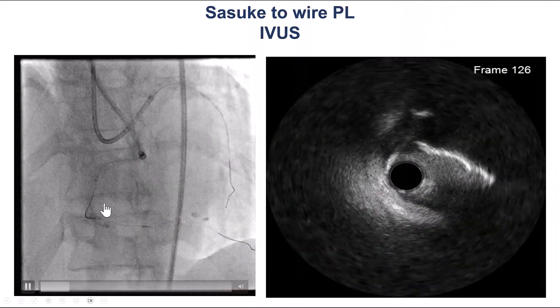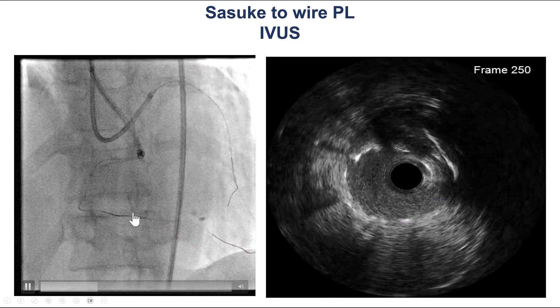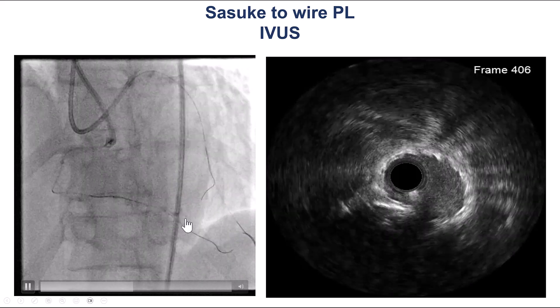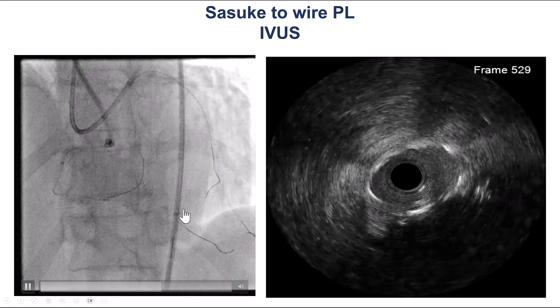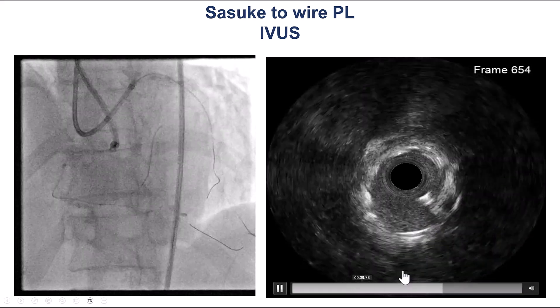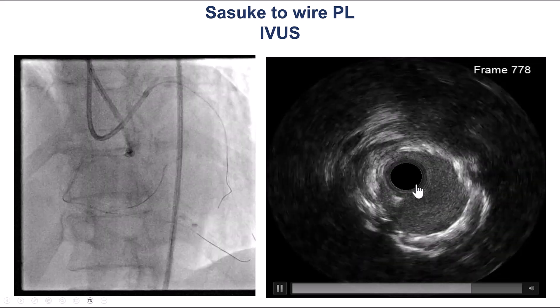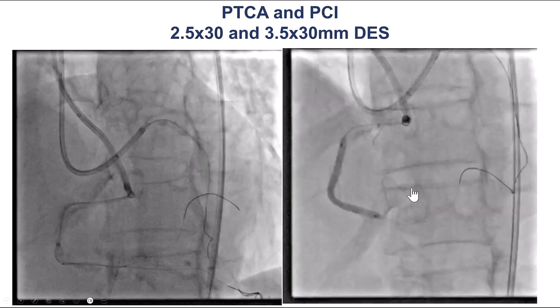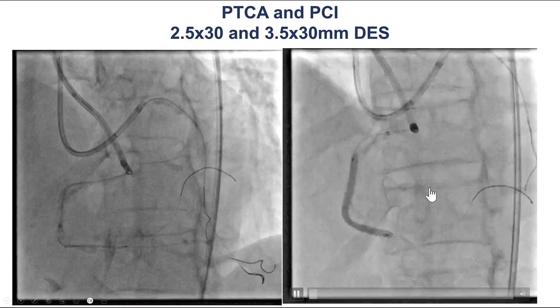We wanted to secure the posterolateral, so we used a dual-lumen Sasuke microcatheter and were able to advance a guide wire into the posterolateral. After probing attempts from different vessels, we did intravascular ultrasound. It turned out there was an old stent in the right coronary artery, which was hard to see given all the calcium.